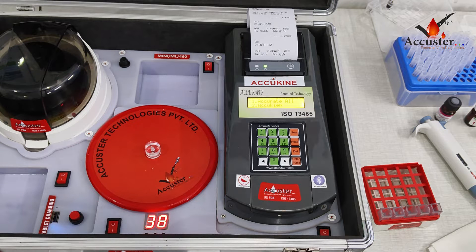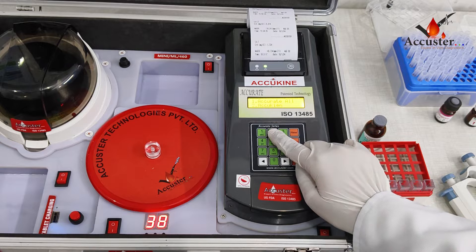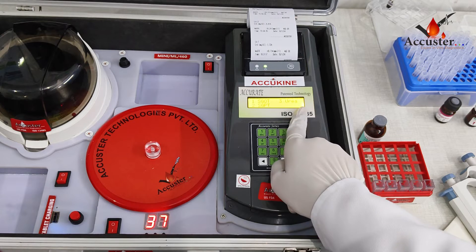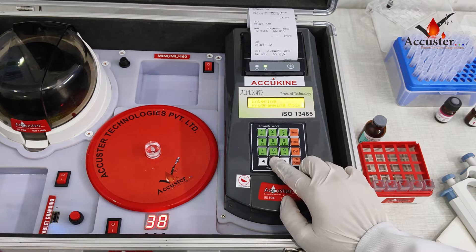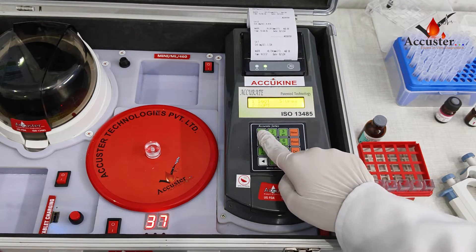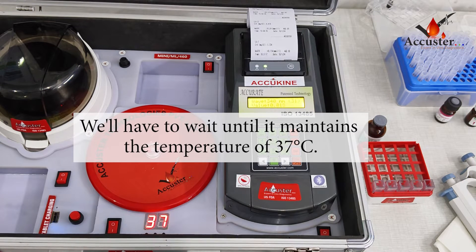Let's begin with the test process. On the biochemistry analyzer, you will see two options on the display: the first is acu-all and the second is acu-kine. We will select acu-kine by pressing 2 to perform the SGOT test. In acu-kine mode, three tests are performed: SGOT, SGPT, and Urea. To maintain the temperature of 37 degrees Celsius, press the 0 button, then enter 0 three times, then press 5. Then select SGOT by pressing 1 and wait until 37 degrees Celsius is maintained.